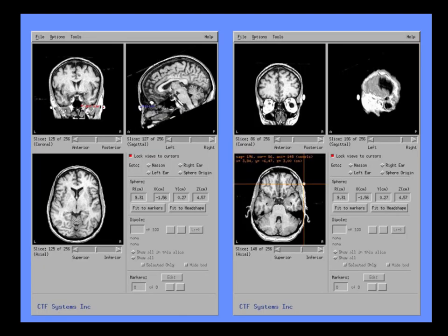So that's what's shown here. This is that nasion capsule, except instead of the coil, we've pasted on a vitamin E capsule at that same spot. And then these are the preauricular vitamin E capsules. And so if you locate those and click on them, this is actually a homemade program that's part of our CTF software, but AFNI has a whole set of tools for using fiducials like this to align things, and that's how we get back from our spatial reference of our MEG coordinate system and reference it to that person's exact anatomy.